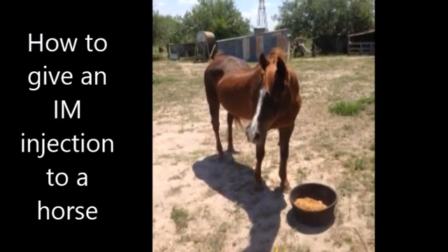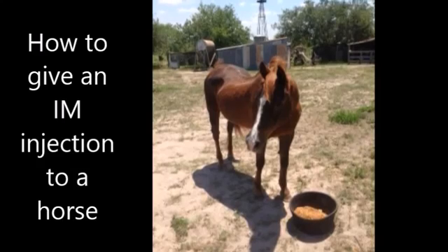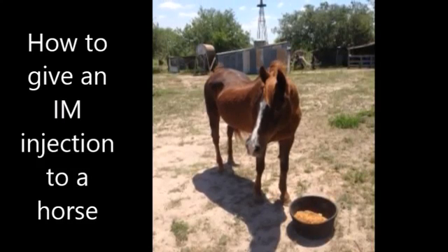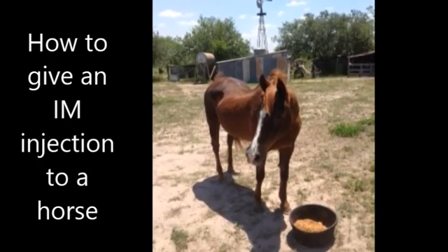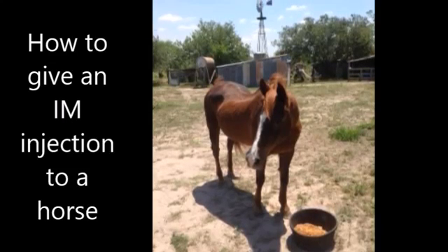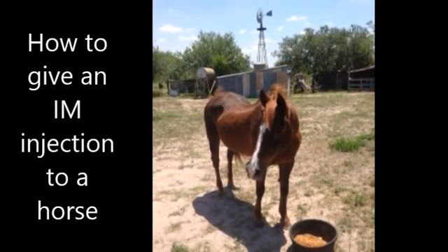The majority of horse owners must eventually learn how to give their horse an injection. Fortunately, this is an easy skill to learn. An intramuscular, or IM, injection is given deep into large muscle masses where the drug can be slowly absorbed into the body. IM injections are the easiest injections to give, and most horses quietly accept the shot.